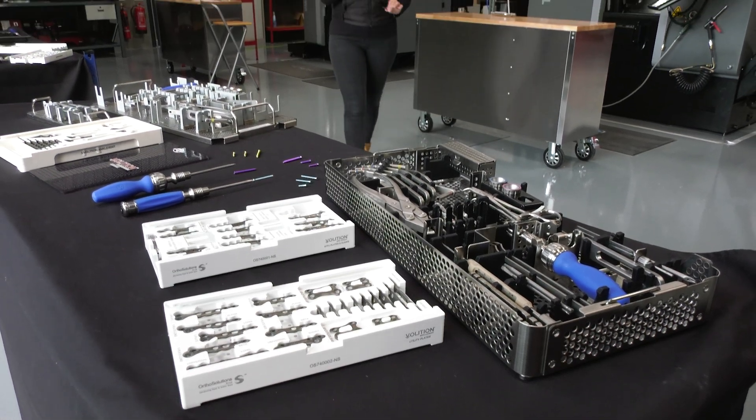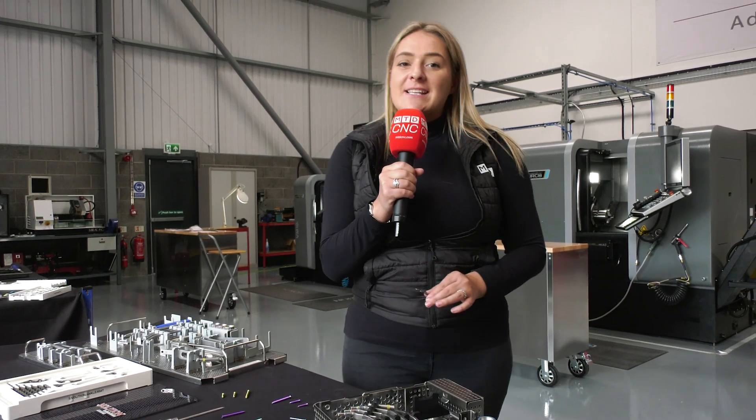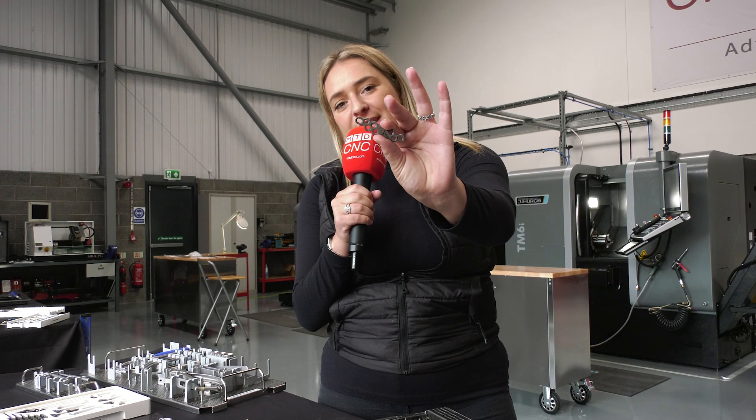In the UK alone there are thousands of surgeries to repair broken ankles and feet. Today we've travelled to OrthoSolutions to find out just how they knit them back together.